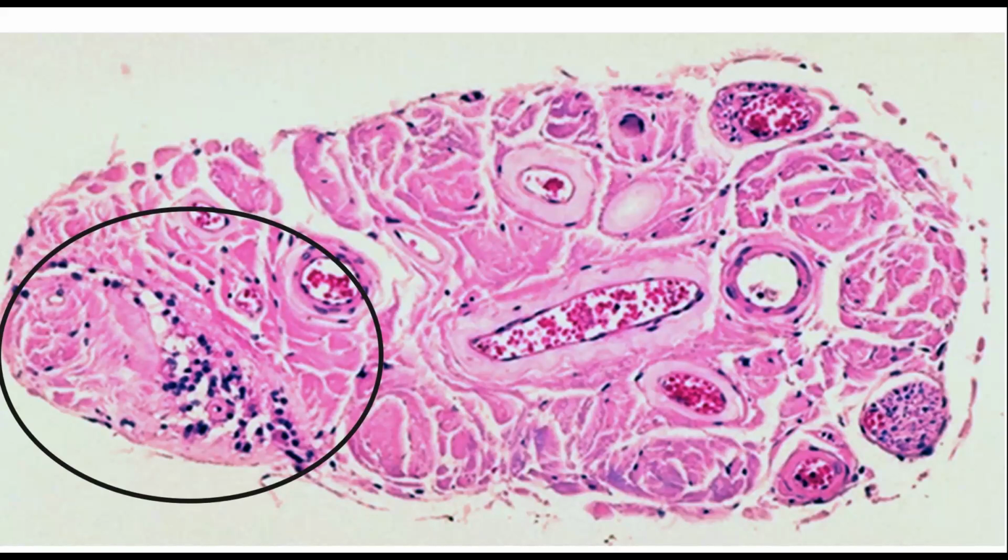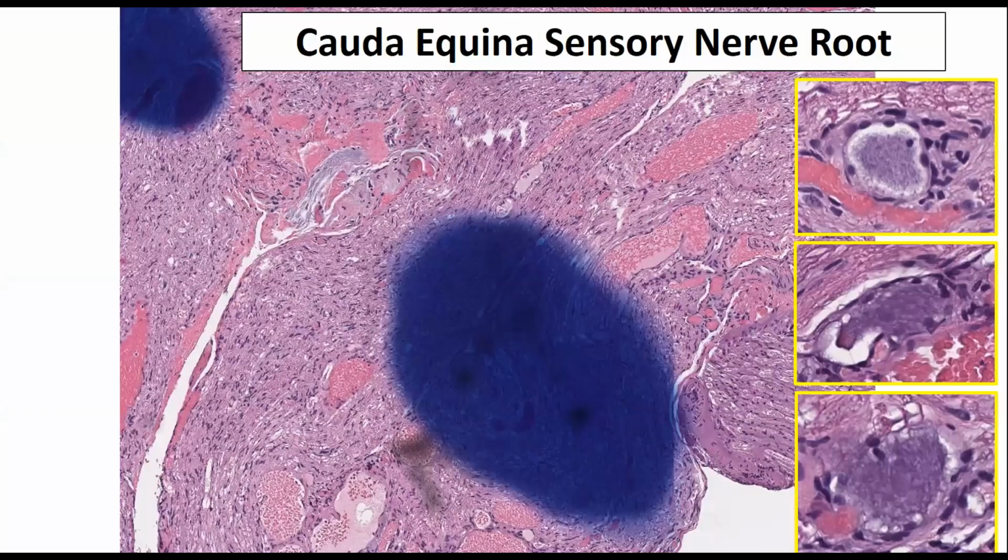Look to the far right of the screen. Do you see that little layer, all broken up, kind of artifactual? That's the capsule of the filum terminale. That's the pia. Imagine the tumor originating there. How easy is it going to be for it to break through? Now, many do not. Thank goodness, or we would have 100% dissemination and all the morbidity and ultimate mortality that goes with that over a decade or two. But many do, and it's easy to understand why.